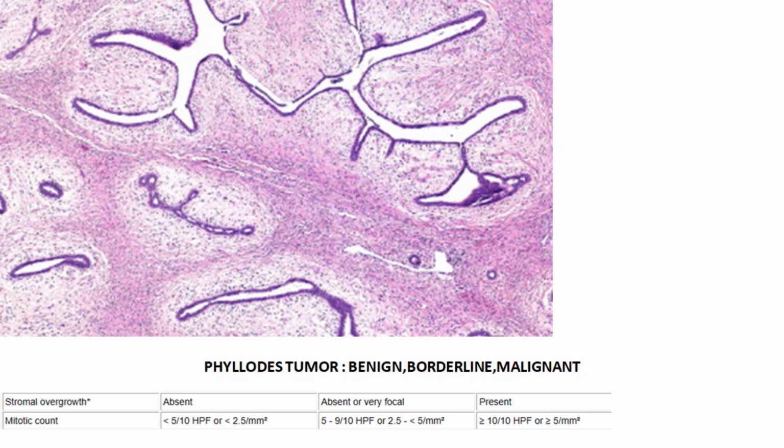Okay. Now, another important entity that you must know is your phyllodes tumor. It can be benign, intermediate, or malignant, and if it is high grade phyllodes, the patient usually will have a very short history of rapid growth, and 20 to 30 centimeters in diameter, firm to hard consistency. What does a phyllodes look like if it is low grade? A low grade phyllodes usually has these leaf-like structures, right? There's a nodular structure with a prominent stromal proliferation. So phyllodes has a stromal proliferation.